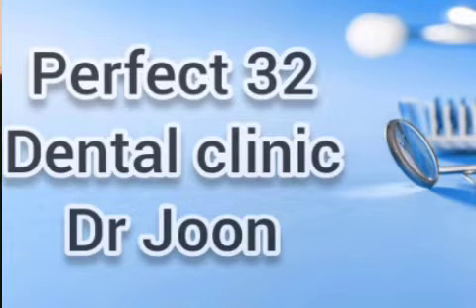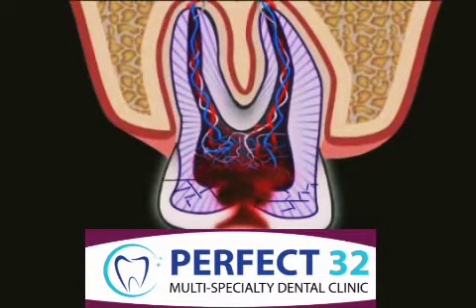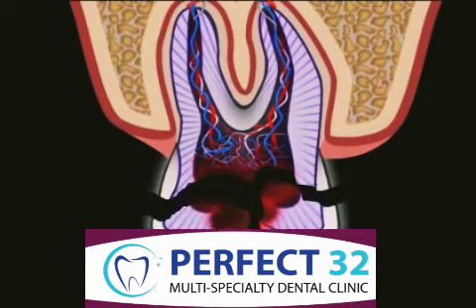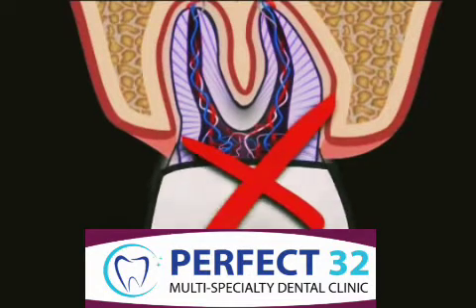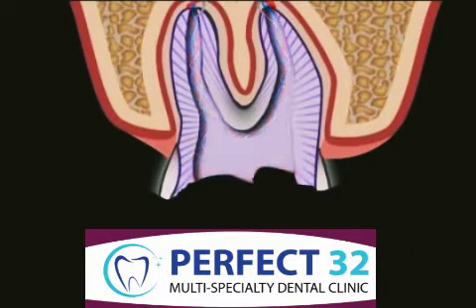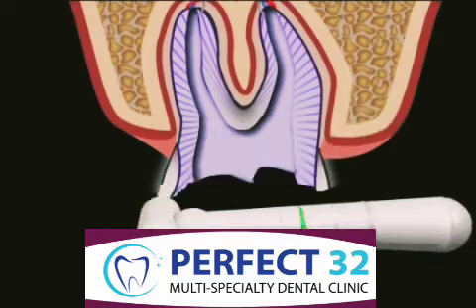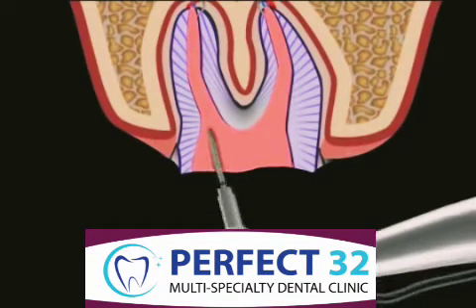Core buildup, or post buildup, describes an artificially created tooth core. If a tooth has been destroyed by a deep cavity so that there is nothing left of the tooth's original crown, then it won't be possible to fit that tooth with an artificial crown because the crown won't have any hold. However, in cases where the roots are still healthy, then a good root canal treatment and the buildup of the tooth core can create retention for a crown.